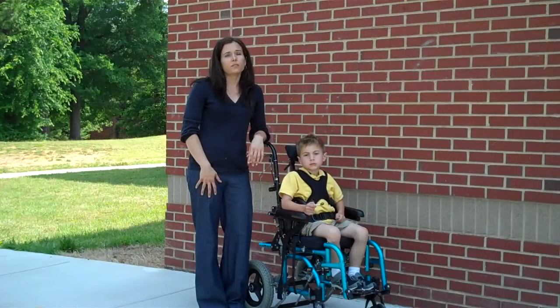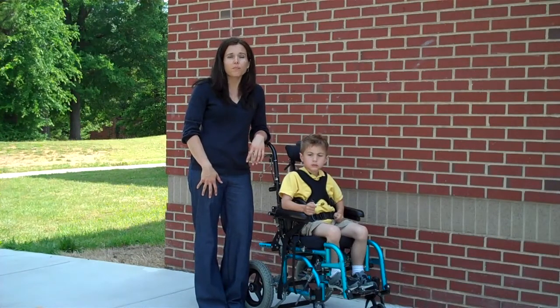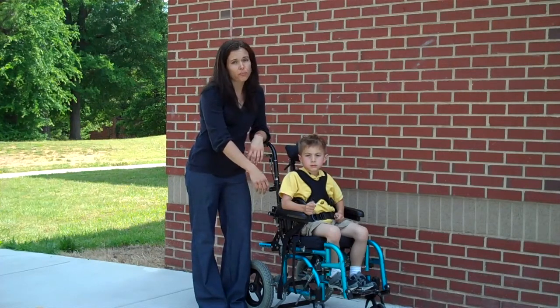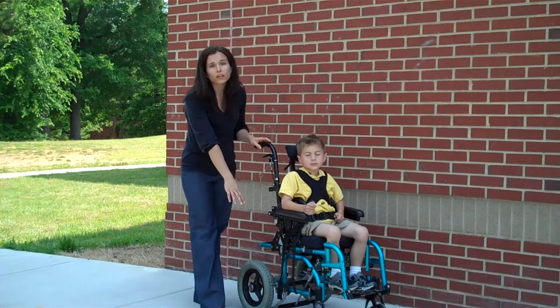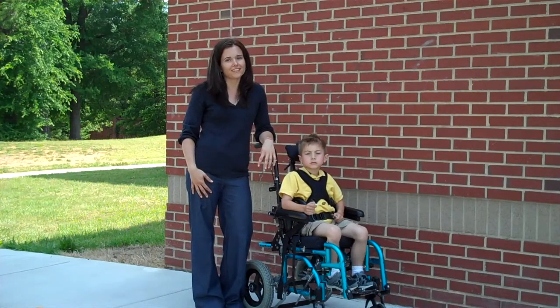Keep in mind that a majority of the accidents occur outside and are completely preventable by following a few simple guidelines. Always make sure that the pelvic positioning strap is secured, that the wheel locks are engaged, and that you stay away from stairs, curbs, and inclines.